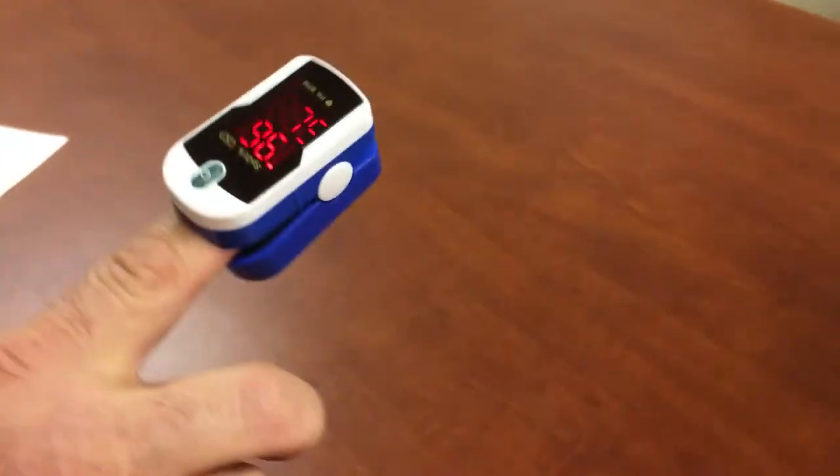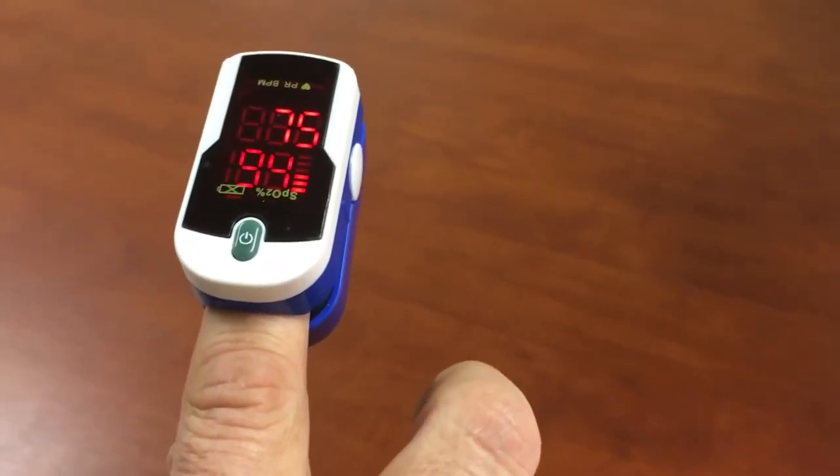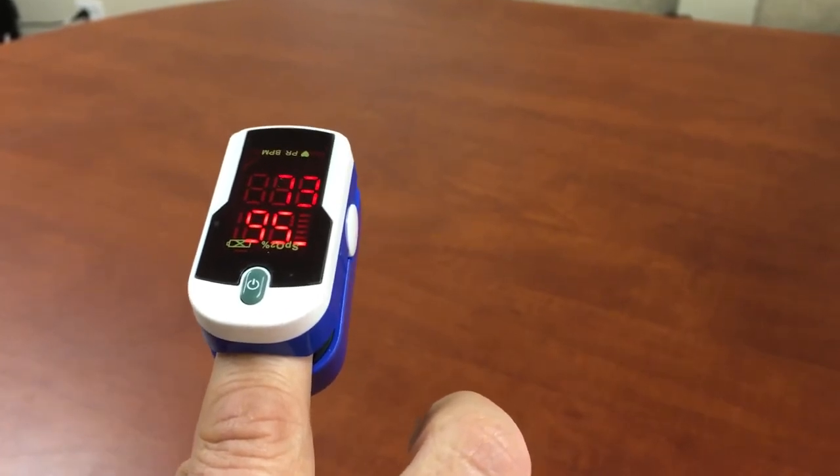Press again and the numbers are facing the person wearing it. You can be assured that you are looking at the display from the correct side if the pulse strength bar is moving from the bottom upwards.